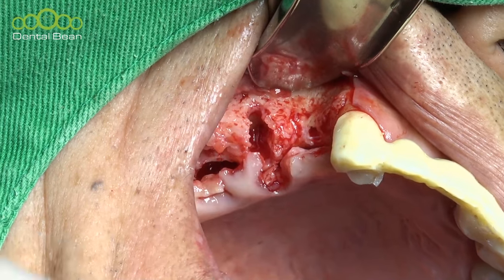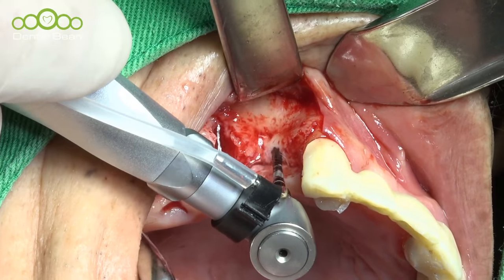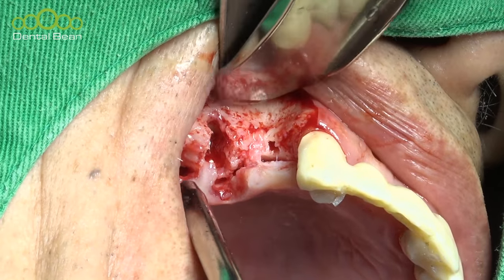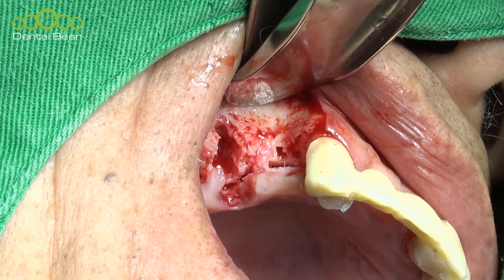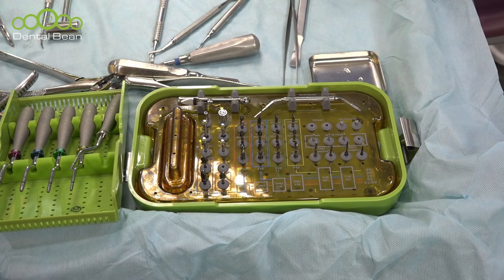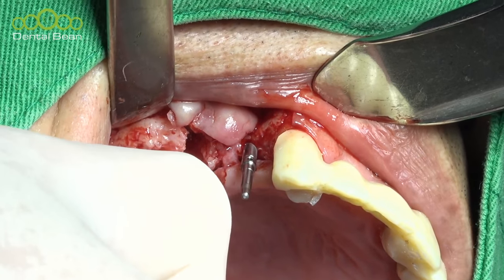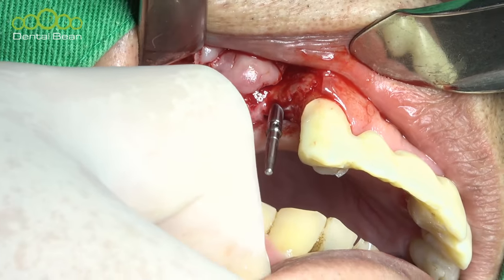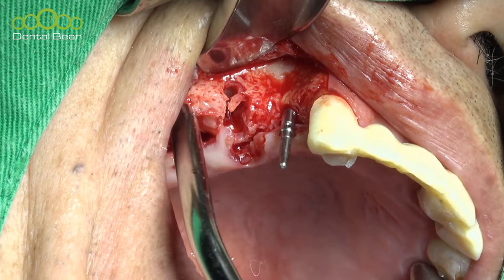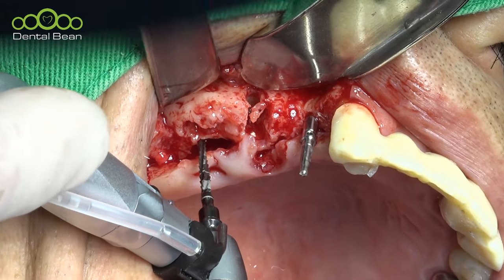Okay, next one, 2.2, 10mm. Residual bone maybe 5 or 6mm.